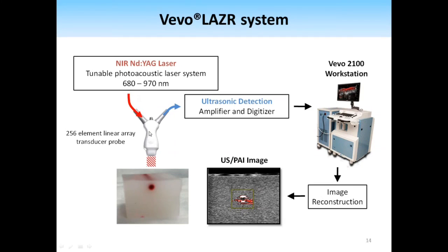This laser is coupled to the photoacoustic probe through optical fibers, which are integrated along this ultrasound probe right here at the surface. Just as an example, let's say that we have some kind of tissue that has blood, like a single blood vessel. So we pulse light into this phantom, or this tissue with a single blood vessel. We'll get our sound waves coming back, which will be detected with the ultrasound component of this probe.